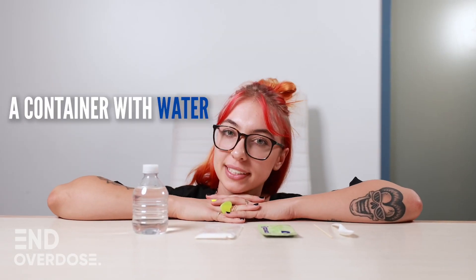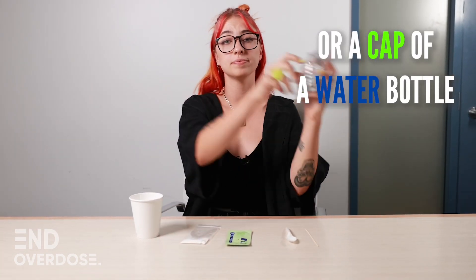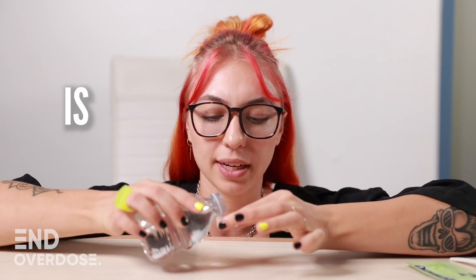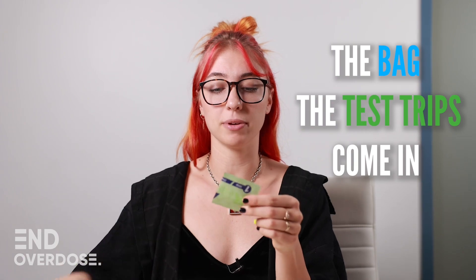Step one, you're going to fill a container with some water. For this, you can use a cup or a cap of a water bottle. Fill your container with about 15 milliliters of water, which is about a tablespoon. Or you can even use the bag that the test strips come in.